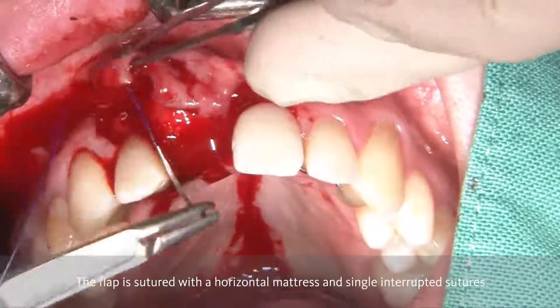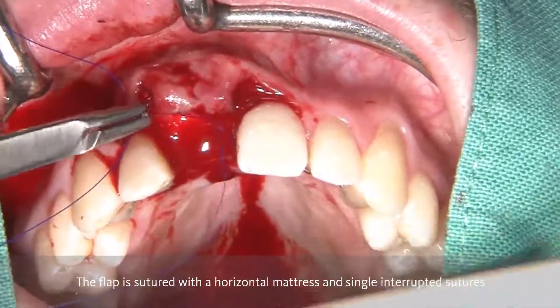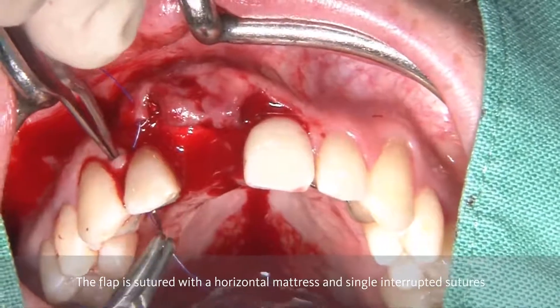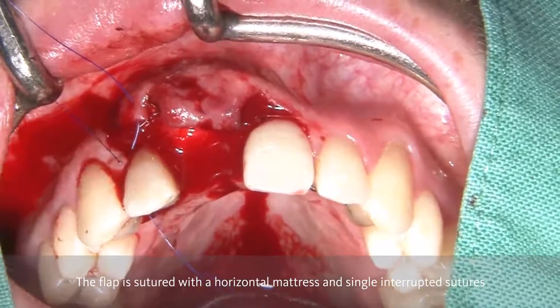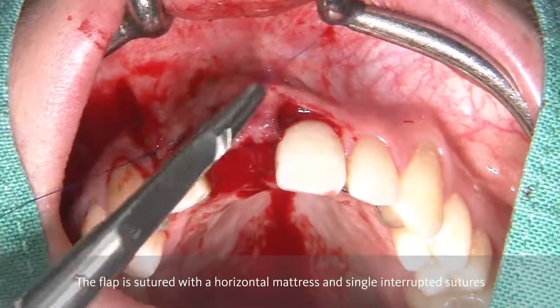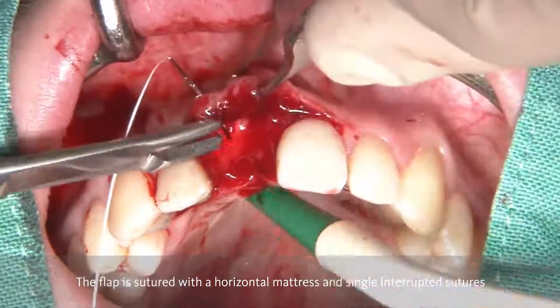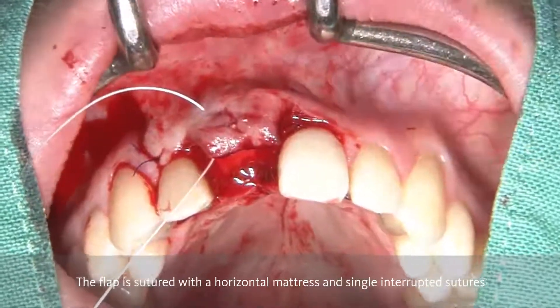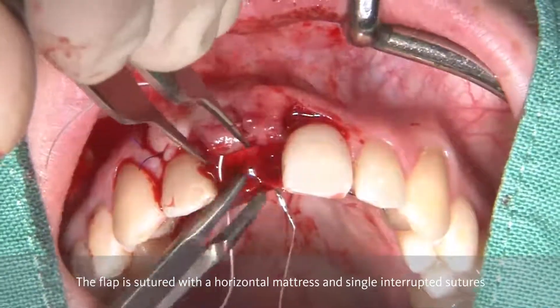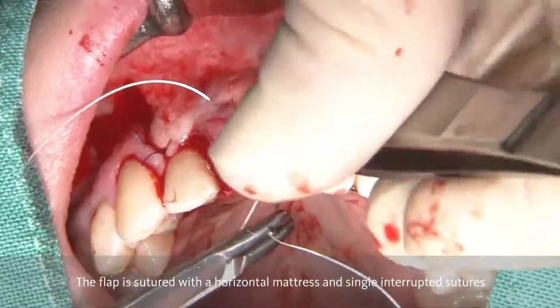In order to be able to close the flap, because we now have extra volume, it is necessary to do a periosteal releasing incision as has been done here. Then it follows by having the first suture at the corner of the vertical releasing incision with a 5-0 or 6-0 suture in order to adapt the flap in this area, repositioning the flap at the correct position. The subsequent suture is for me the most important one — it is the horizontal mattress, performed with an ePTFE suturing material which has great elasticity, being very gentle to the wound, and is important in order to keep the wound margins together.